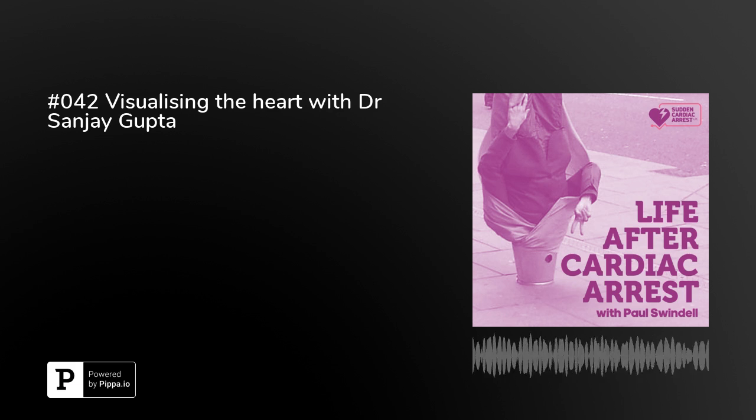But since echocardiography has come along, and now we have more complex echocardiography. Previously we just used to have something called M-mode echocardiography, then changed to two-dimensional echocardiography. Now we have three-dimensional echocardiography. So that has really revolutionized how we diagnose certain conditions and how we monitor conditions, because it is accessible. You know, the machines are not that expensive. There's a lot of expertise, experienced staff, etc.